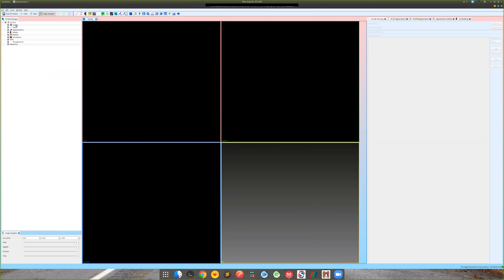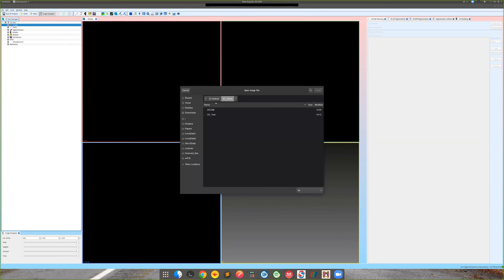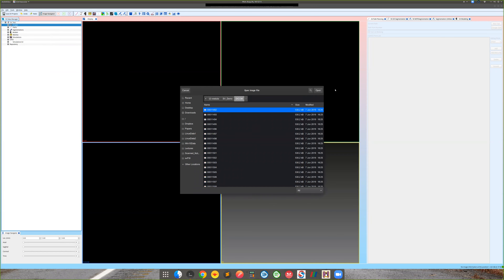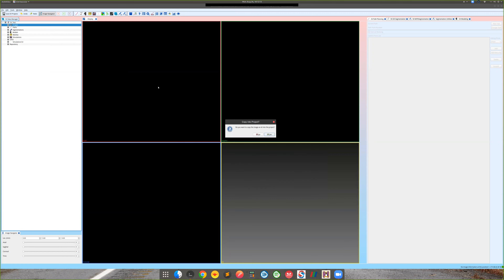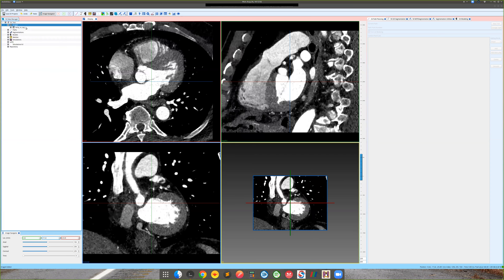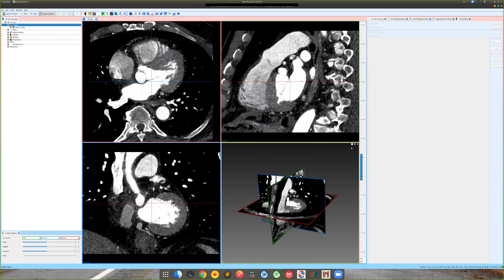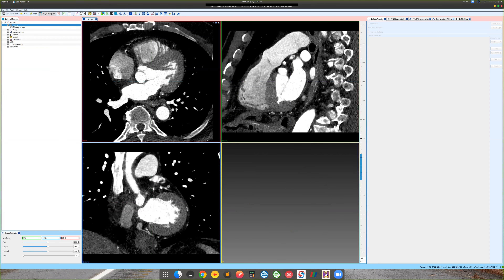We're going to start by loading an image. We'll use DICOM data — CT-based DICOM data — copy it as a VTI, and scale the image, converting from millimeter scale into centimeter scale. I'll give a name to this image. While the image is loading, I want to give a brief introduction to the 3D segmentation tool.